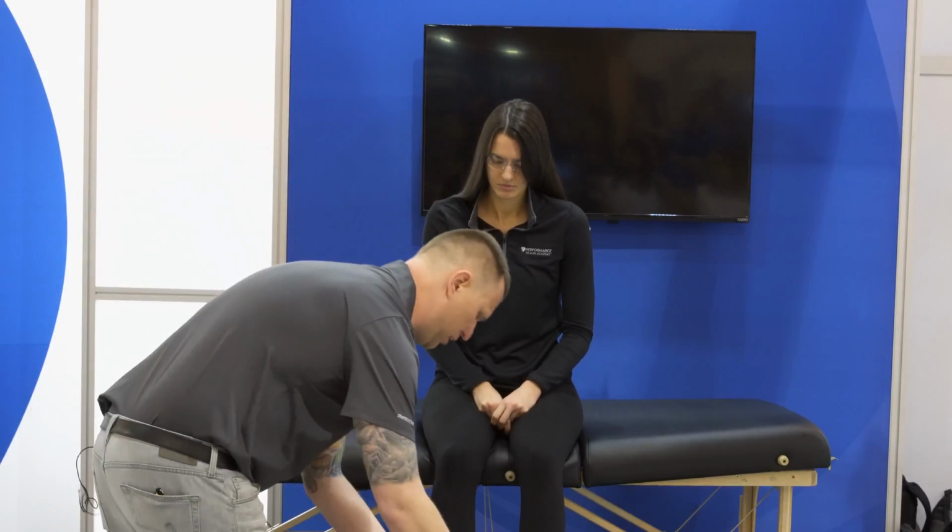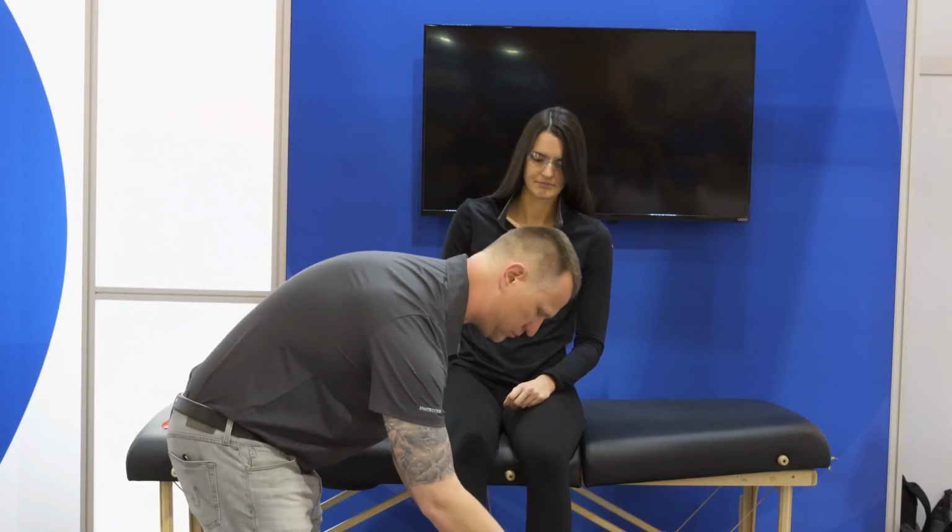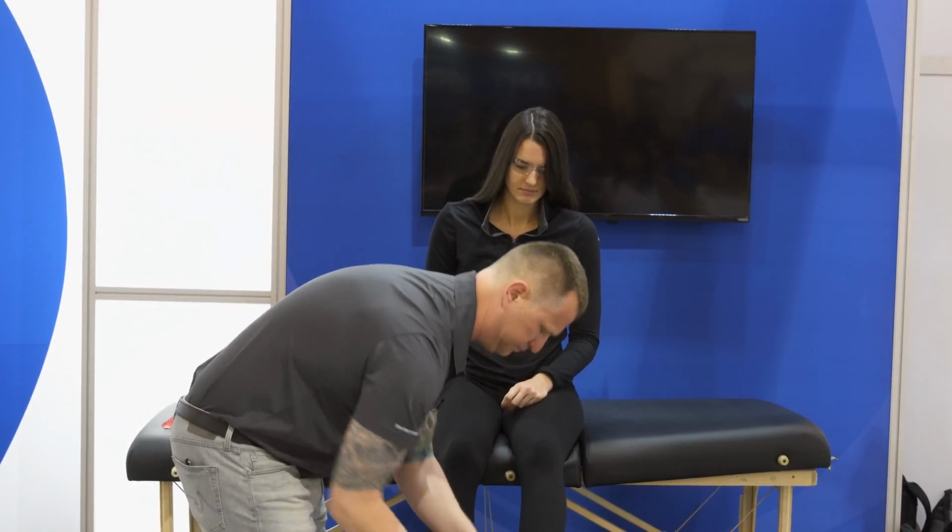Well, we can certainly do manual exercises, we can do flat band exercises, things of that nature, but can we progress from traditional single plane exercises to multi-plane? So I can take something like the CLX in a seated position and simply loop that around the feet and then come back down. So we've created loops in the system so we don't have to be tying knots. We don't have to create an artificial loop and so forth.